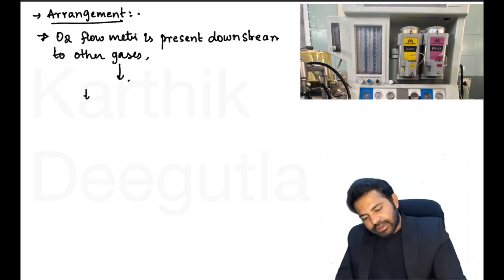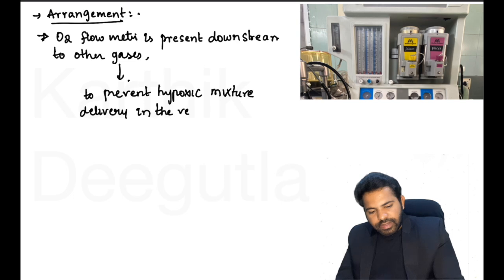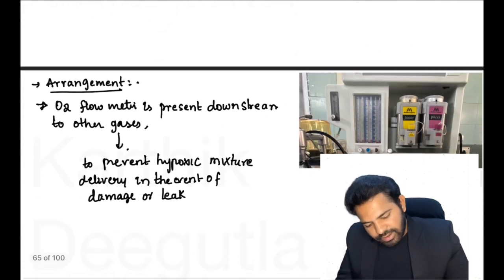So, to prevent hypoxic mixture delivery in the event of damage or leak. Clear? Here in this picture you can see the oxygen is present downstream. Okay.